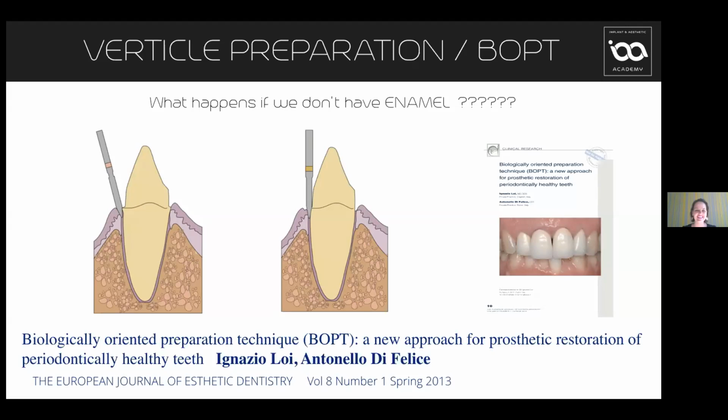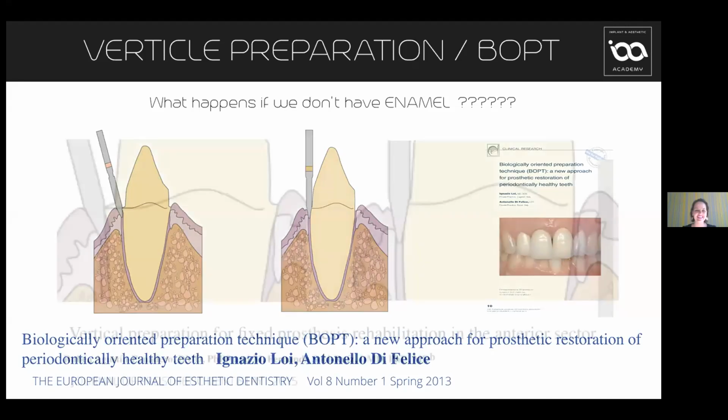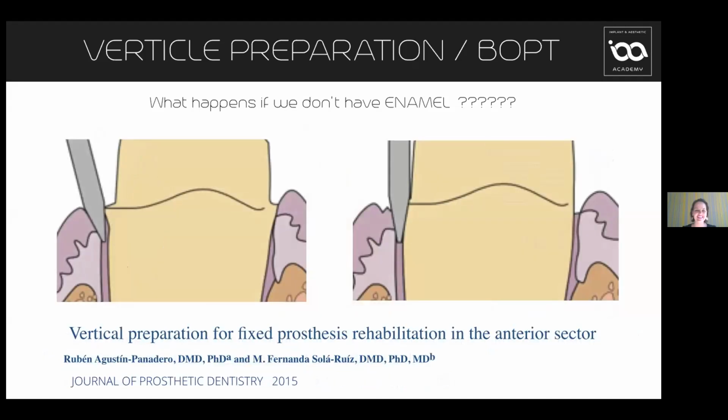Essentially, we go through the same principles more or less as normal tooth preparation. The only difference is that instead of using either a round-ended or a flat-ended burr, we use a flame burr, like you can see here, and we eliminate that margin. So this is the crucial part. The only thing I would say, this is the last part of the preparation, the last thing you do. At this point, it can be quite easy, if you angulate the burr too much, to create an undercut.